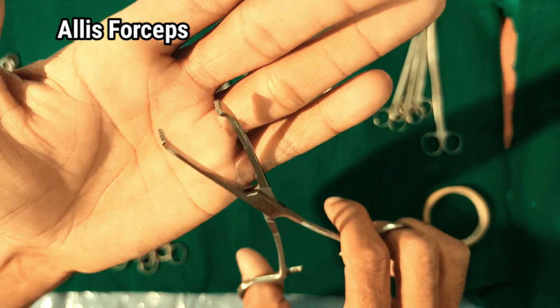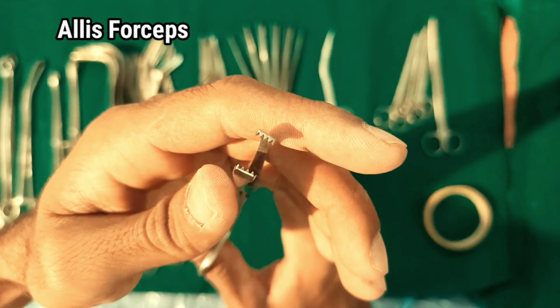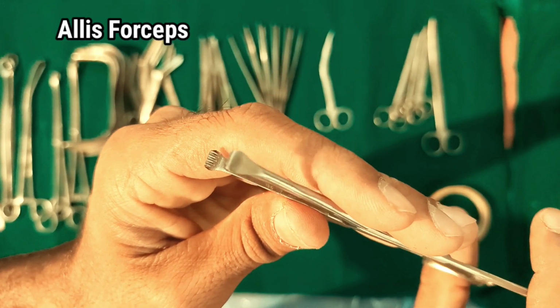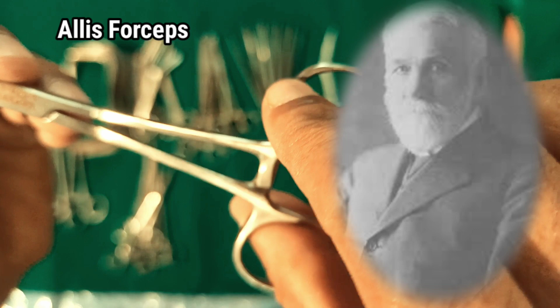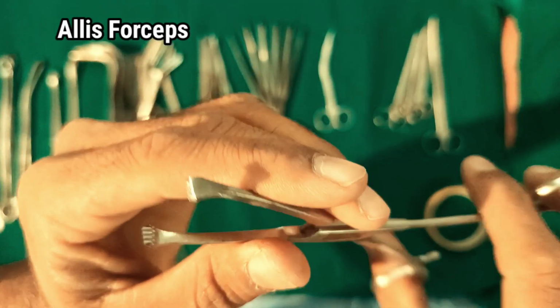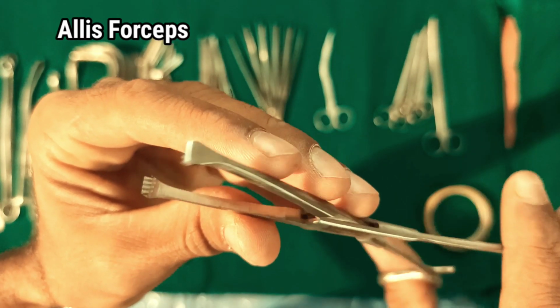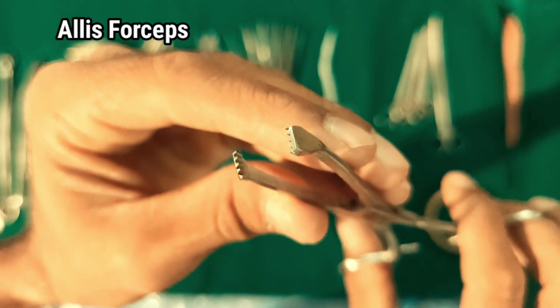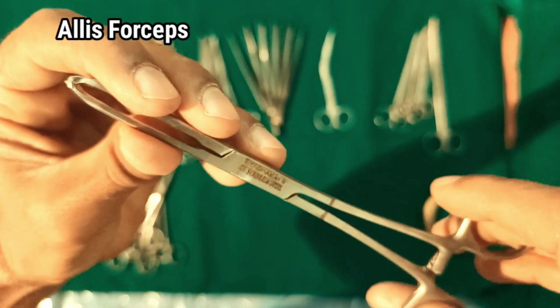An Allis clamp. An Allis clamp, also called the Allis forceps. Allis forceps is a commonly used surgical instrument. It was invented by Oscar Allis. The Allis clamp is a surgical instrument with sharp teeth used to hold or grasp heavy tissue. It is also used to grasp fascia and soft tissue such as breast or bowel tissue.